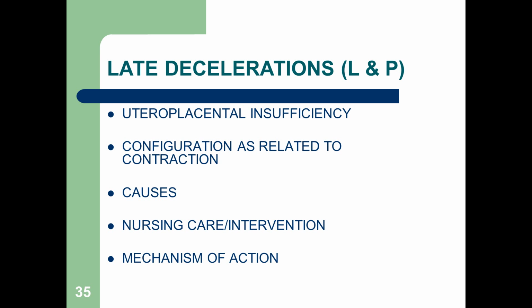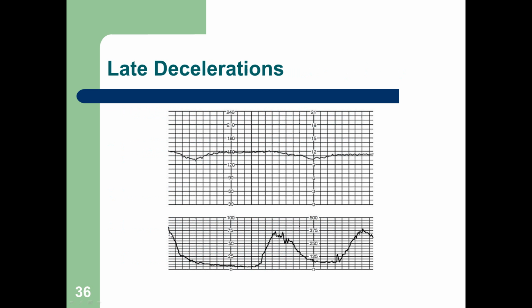So let's look at some late decels. Okay, the contraction is starting to end, and it's starting to relax. Can you see the late deceleration? So the heart rate is decelerating late. That's after the contraction starts to resolve itself. Here, this one is a little bit better even. And see, it's not too far. The deceleration is not too far off the baseline, okay? So it's decelerating while the contraction is relaxing, okay?